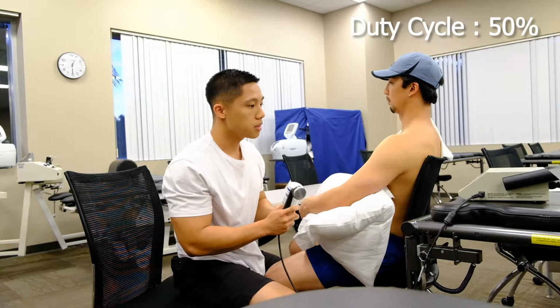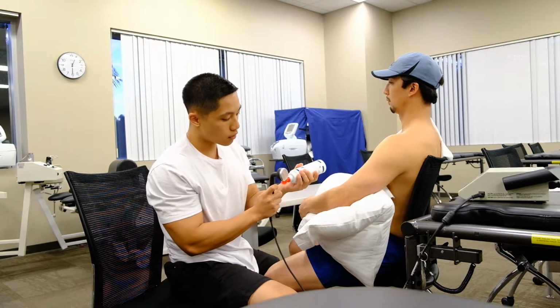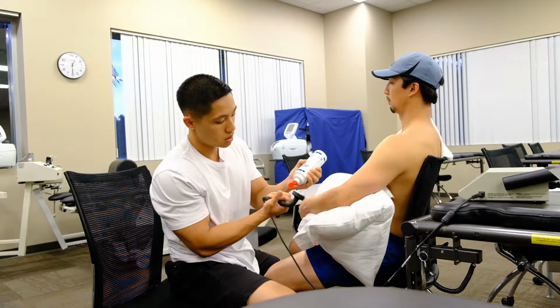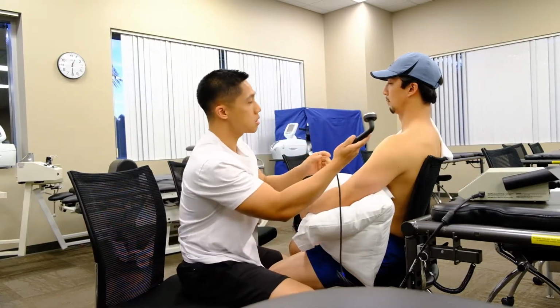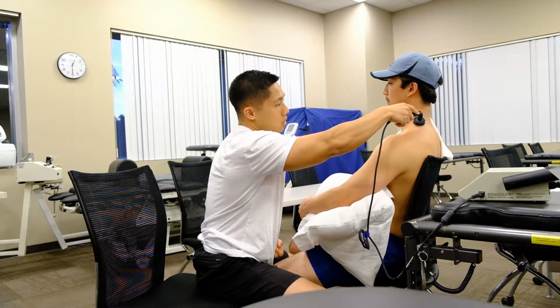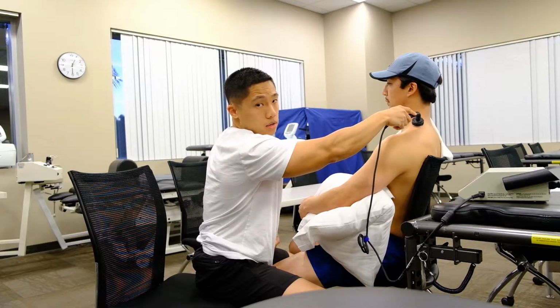All right, and then I'm going to go ahead and start the machine after I apply the gel onto the head, and then applying this on the patient's skin. Are you doing okay? Yep. Excellent. Okay, at this point I will start the machine.